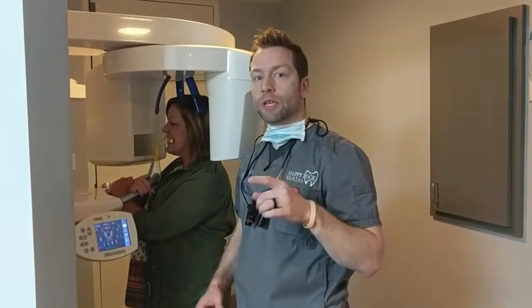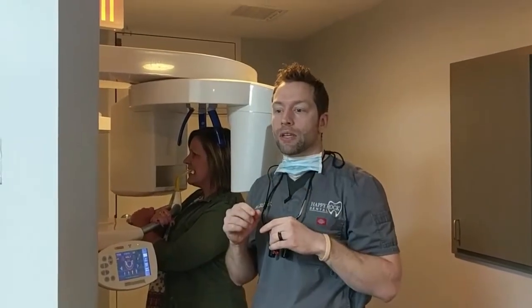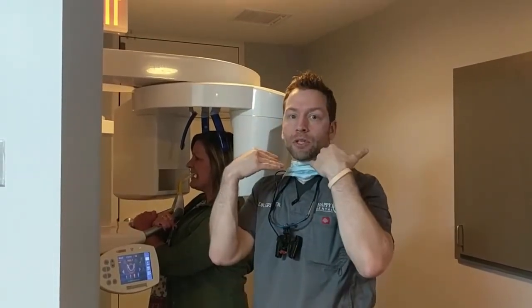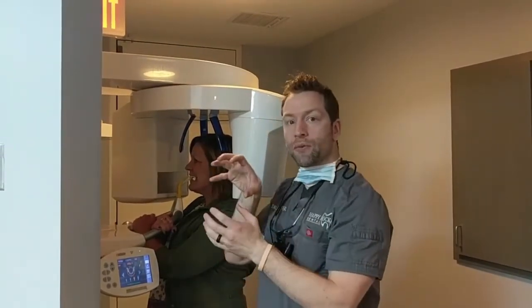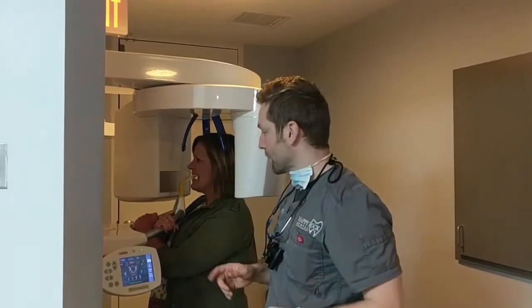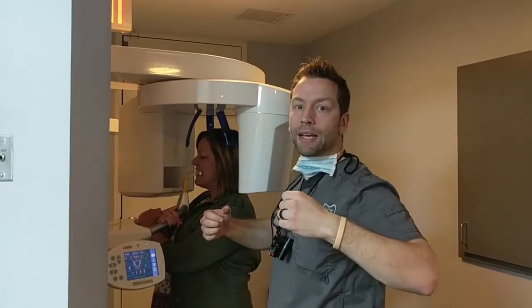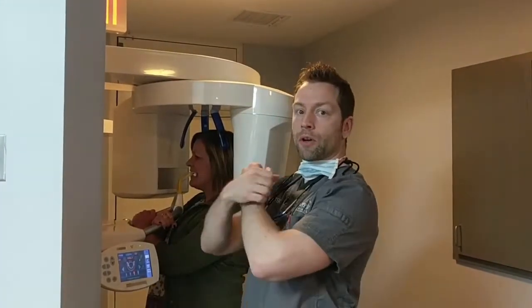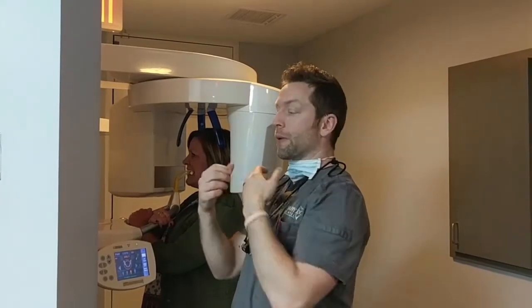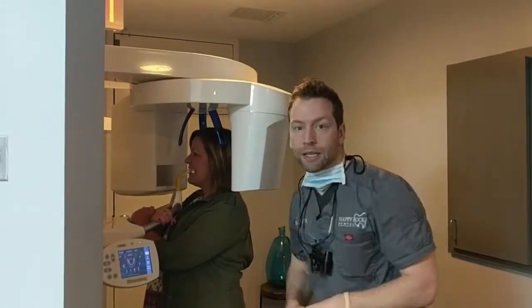For this scan, we have Lucy biting on two cotton rolls to make sure the denture stays seated and doesn't accidentally pop out the back — which is really easy. If she bites on the bite stick, the whole thing will pop out just like she was biting into a chair. She's biting on those with just her front teeth hooked on. She has her arms crossed so her shoulders come together rather than flaring back, less likely to hit the machine. She's got her feet slightly forward as well — bringing everything forward, less likely to hit the machine with her shoulders.